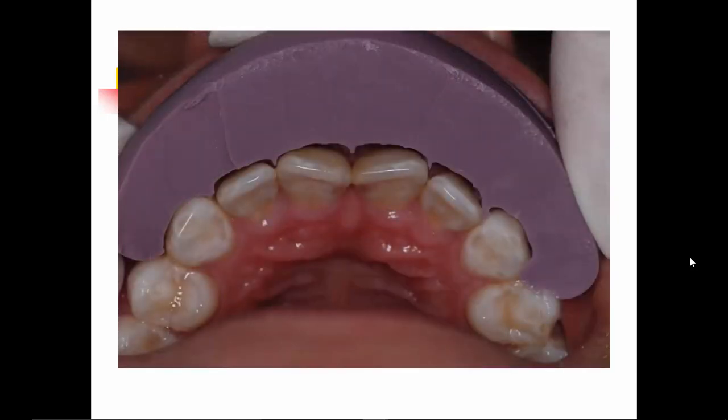I now go back to the mouth, and I'll notice that there are areas of the teeth, especially on the facials of the lateral incisors and the mesial facials of the two centrals, where I need to do very little preparation of the enamel. I'm going to remove that defective composite from the facial surfaces. It's going to guide me as to how I prepare the canines.